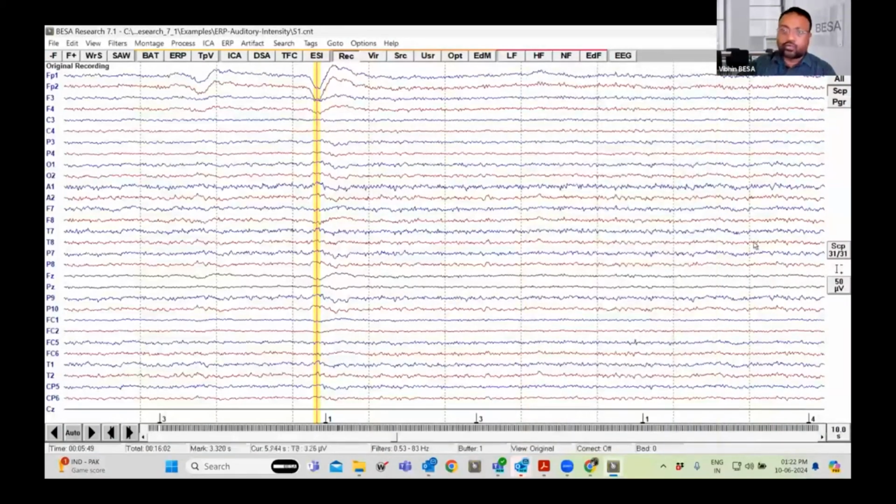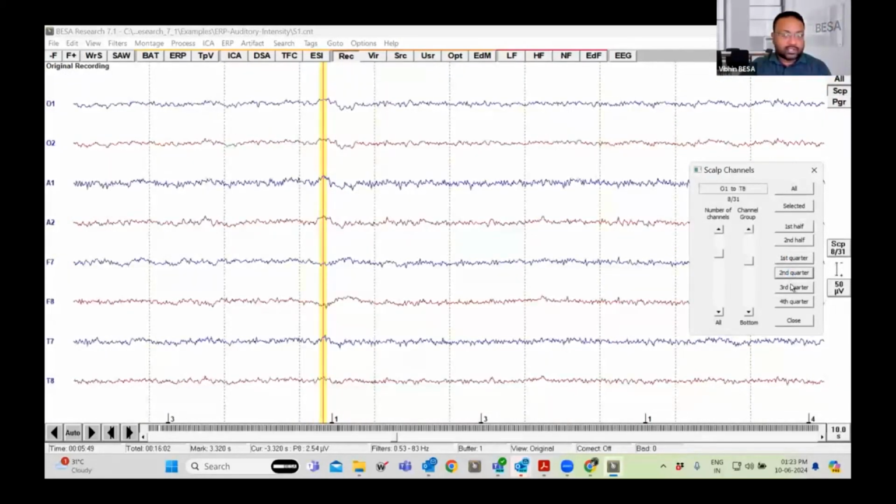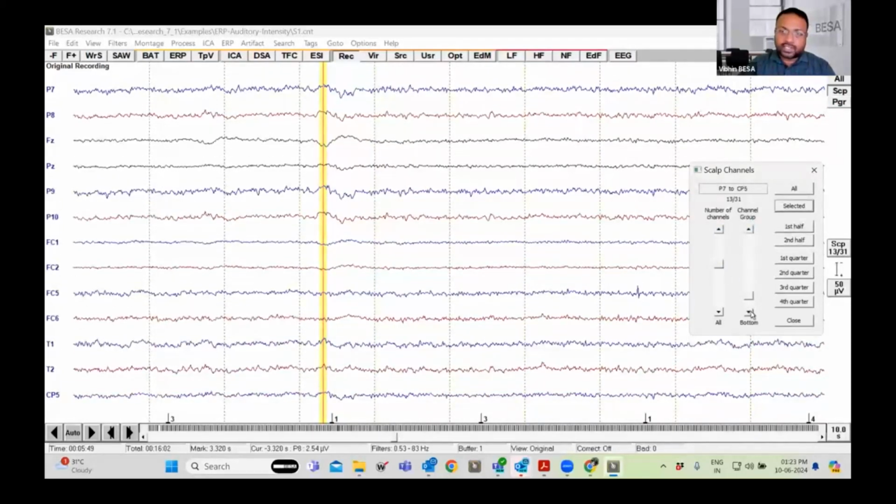One more thing I wanted to show you: suppose you have high density data, 256 channel data. Our eyes are not adapted to see all those 256 channels, or even 128, which will be too big to see in one shot. So we have this option wherein you can click this scalp button on the right side, and you can choose to see the first quarter of the total, second quarter, third quarter, fourth quarter, or first half or second half, depending on how you like to see the data. You can also use these bars over here to see the groups or the channel sets, which will be helpful in really understanding the data quality.